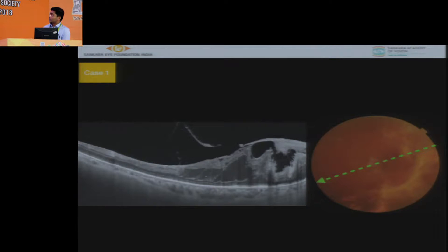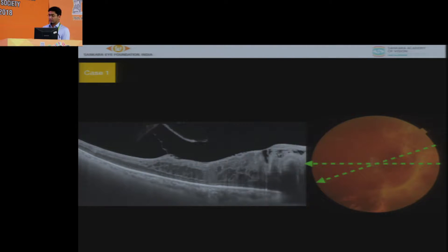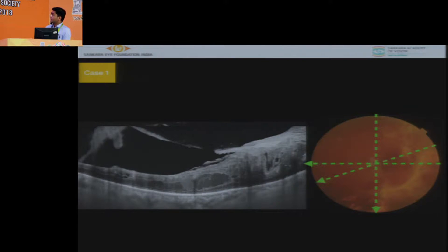What I would see on an OCT - as you can see the dissection plane is somewhere over the macula or the fovea and there is a traction over the macula and the fovea. I needed to understand is there any other plane otherwise. This is the other part of the scan. Nasally till the point it is extending I am not able to see any plane of dissection. Whether there is inferiorly? Inferiorly it is tightly adherent and it is plastered over the retina. Where should I start in this case?